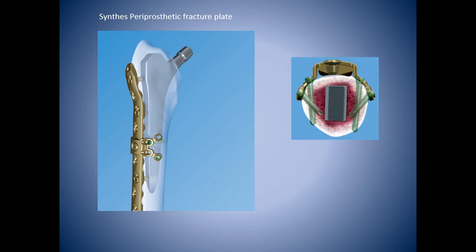And Synthes has got a very nice little fracture plate here, which you can use around the implant, which you can bypass quite nicely, and you can put it at any level, and you just screw it into and over the underlying plate.